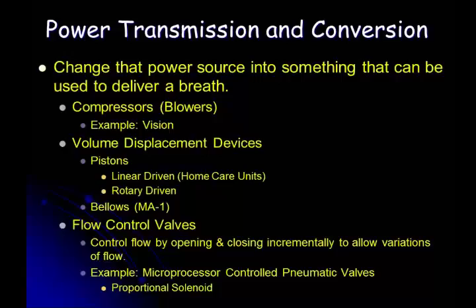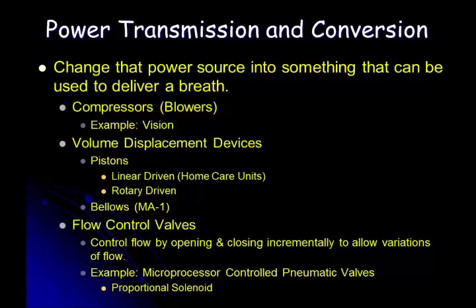That piston, and this gets a little bit geeky, could be linear, boom, boom, boom, boom, or could be rotary, where there's a wheel that is turning, and onto that is the piston. There actually is a difference between a rotary-driven piston and a linear-driven piston. And the difference is in how that gas flows. Okay? And you'll have to trust me on that one.